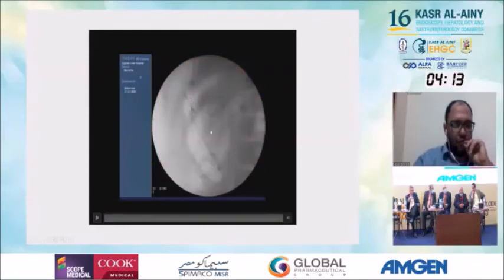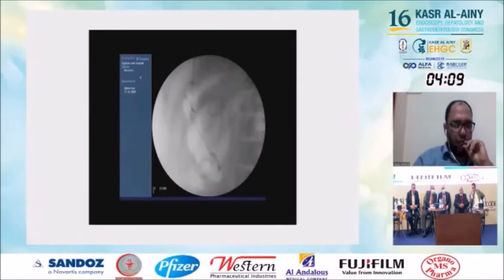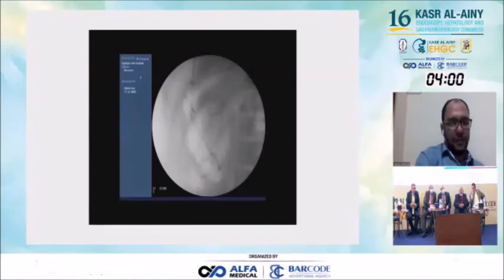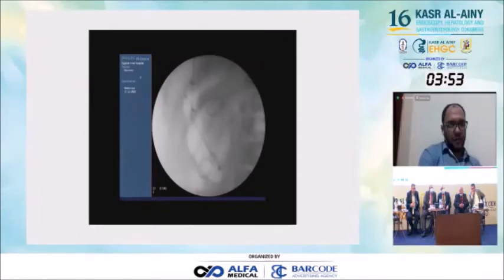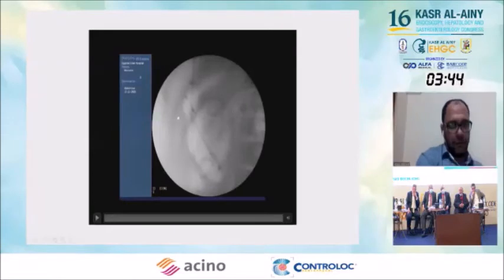This is a transmural stent, and this is the internally migrated stent. Follow up of the patient after the procedure: there is no pain, no fever within 2 days after the procedure. Marvelous response regarding the symptoms. The jaundice subsided, and the pain and vomiting also subsided. One month later, the cyst by ultrasound is resolved completely.